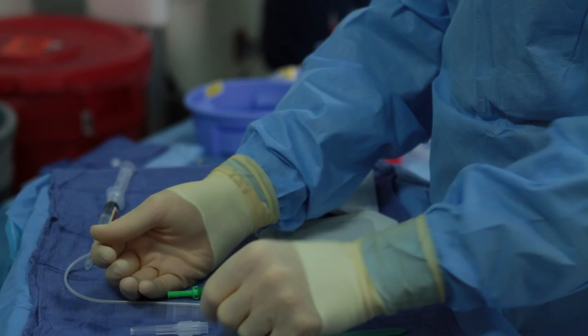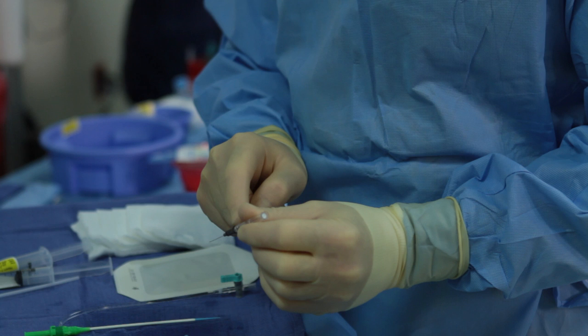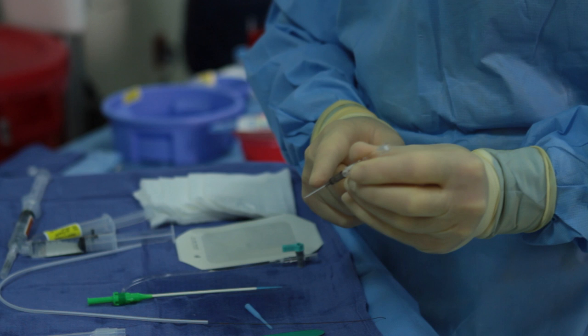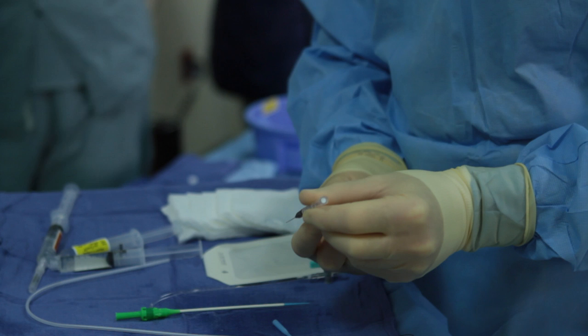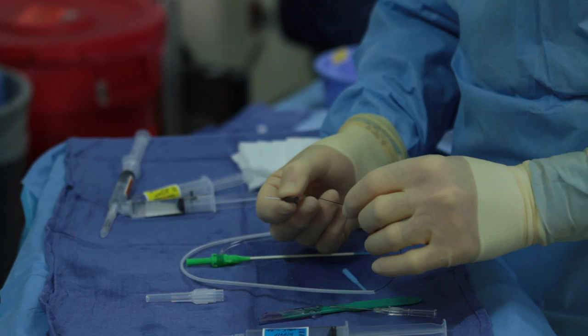We'll then be using our Terumo two-component needle and approaching it in a fashion such as this. We'll puncture the artery, see blood enter the chamber, and when we see that, instead of backing out, we will go forward a little bit to introduce the white cannula either through or well into the artery. At that point, we'll fix the white cannula, hold it, move it back millimeter by millimeter, and the plastic wire will go into the plastic cannula and access the artery.